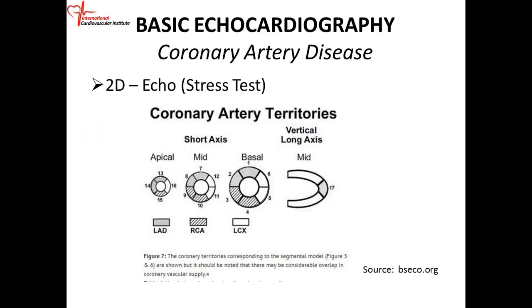All right, so let's go over the stress test. The reason for doing a stress echo is to diagnose coronary artery disease. We want to see if the patient has blockage, and if the patient has blockage, you can get an assessment of how significant the blockages are. We usually use the fact that the resting echo may be normal.